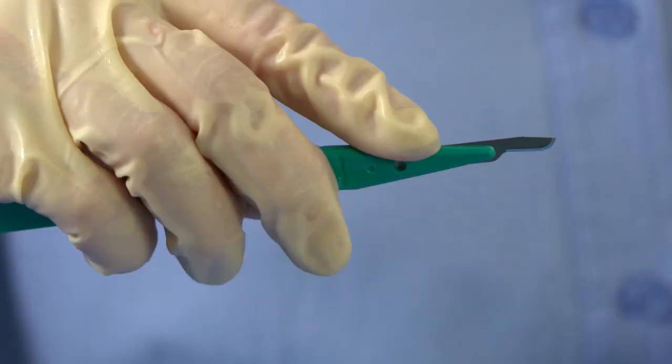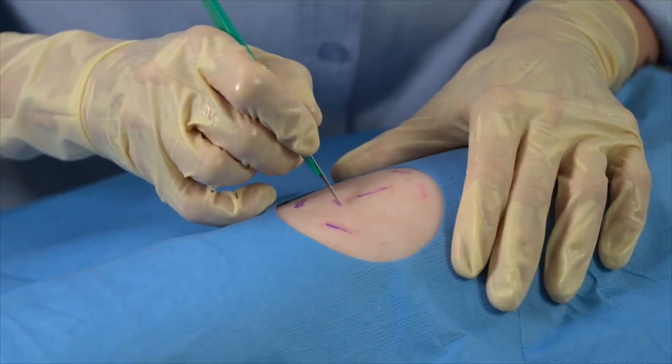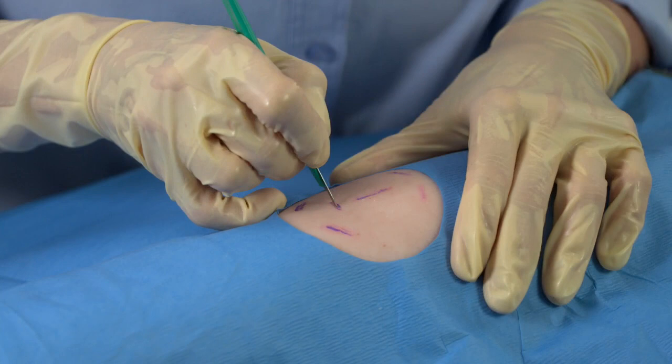Once the area is anesthetized, you'll make an incision approximately 5 millimeters in length, which is the approximate width of the number 15 scalpel at its belly. The depth of the incision is 3 to 5 millimeters, which is approximately the distance from a number 15 scalpel's tip to its belly. Holding the number 15 scalpel with the pencil grip, punch the belly of the blade into the dermis. You may feel and hear a pop.